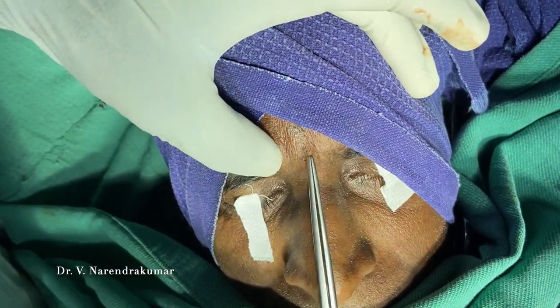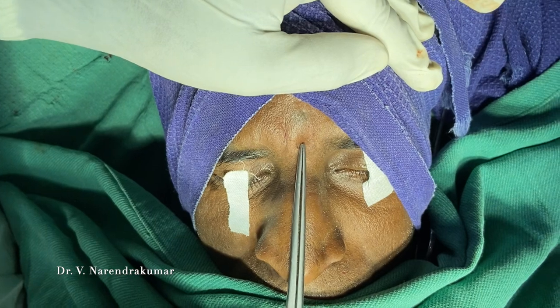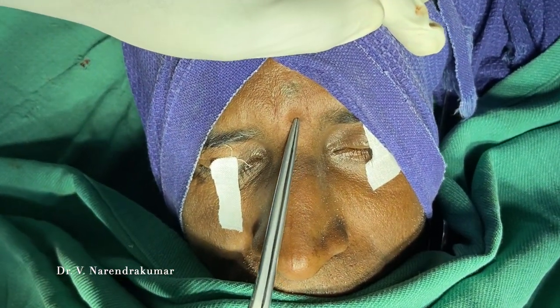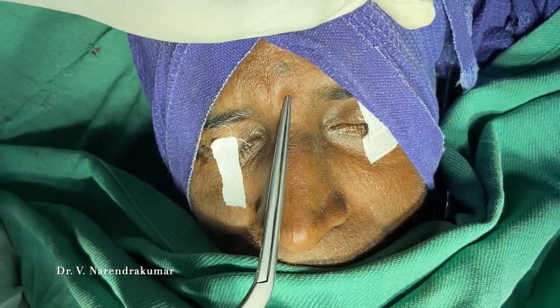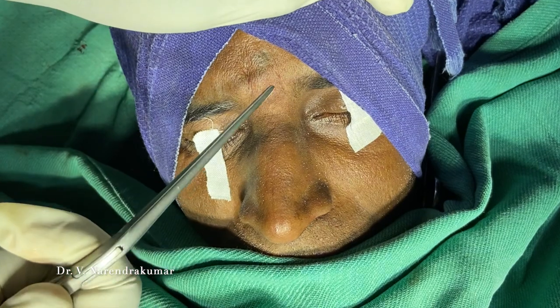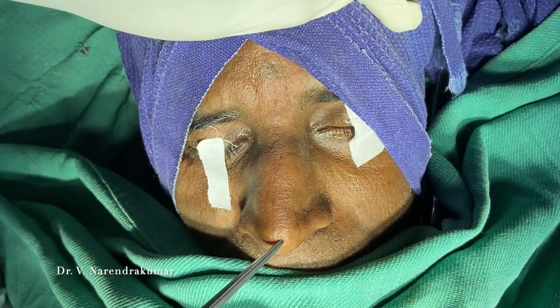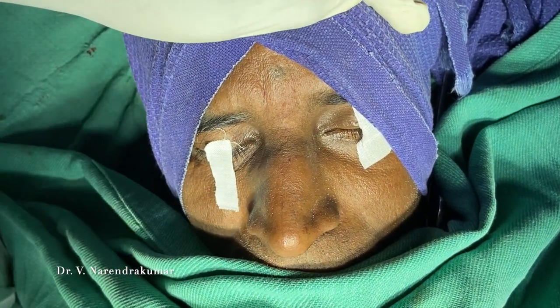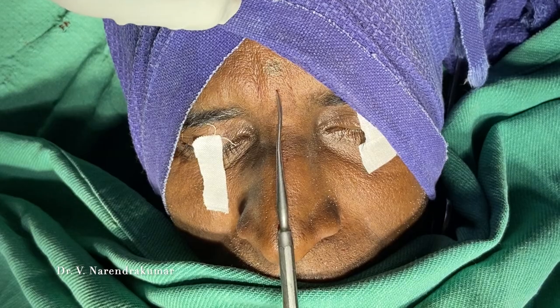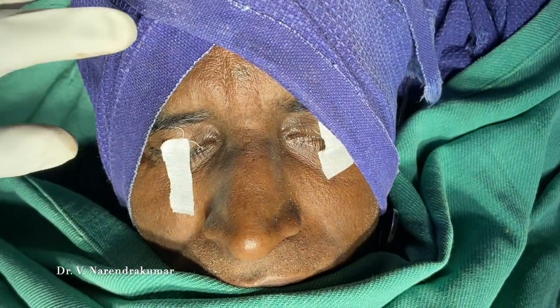We will check the result. Look — the glabella, tip of the nose, and philtrum now lie in the midline. This was angulated before and has now been corrected. All three structures are now in the midline. We have confirmed it.